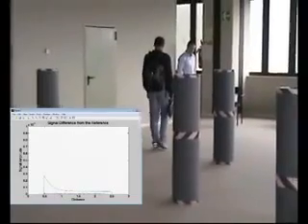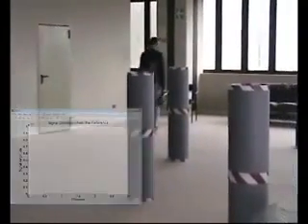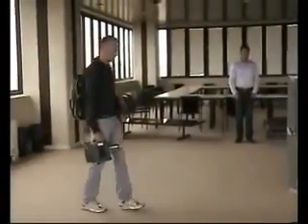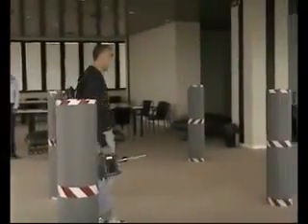As we have just seen, the subject performed the test, reaching the goal in a few seconds without hitting any obstacles. In perspective, the work will be aimed at optimizing the system and at miniaturizing the components so that the device is easier to wear and less visible.